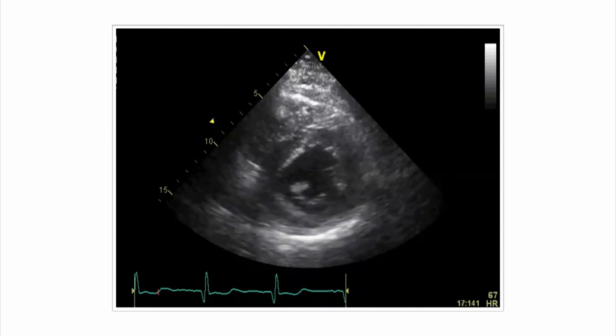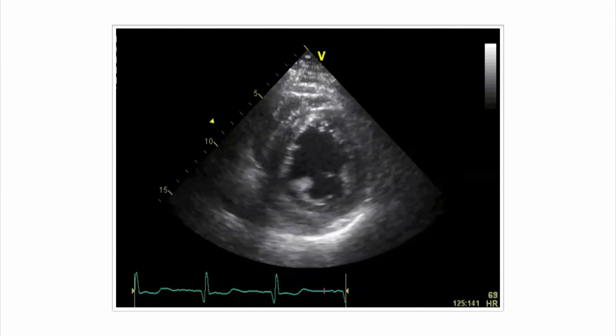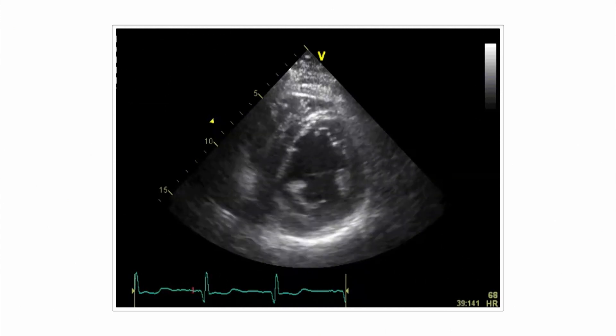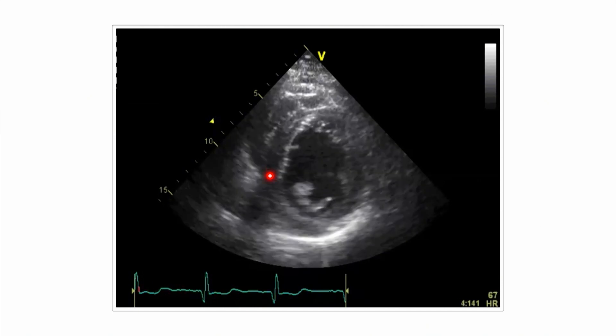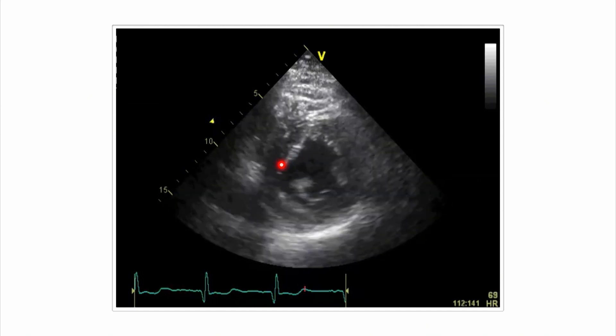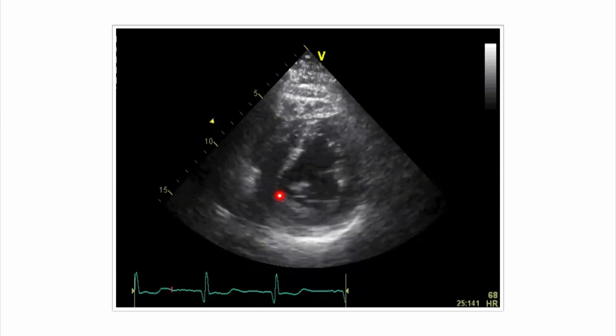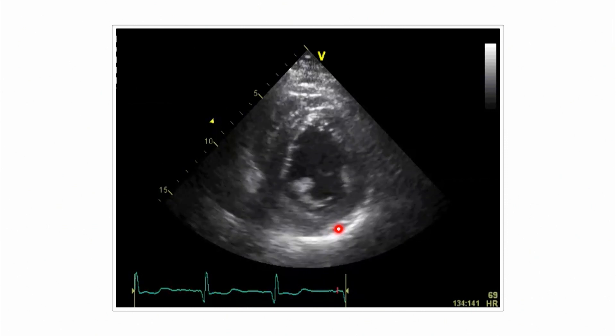If we look at the echocardiogram — here is the two-chamber view — it's quite apparent that there's a wall-motion abnormality reaching from the inferior septum here to the inferior wall.